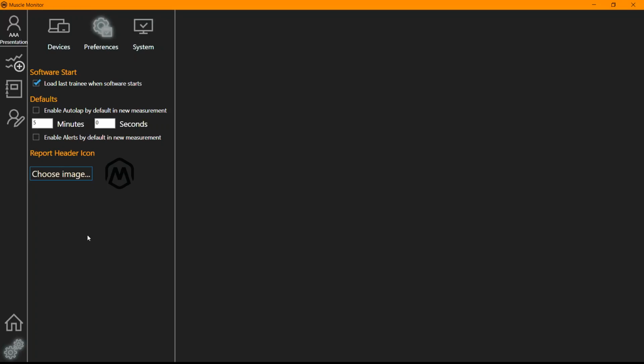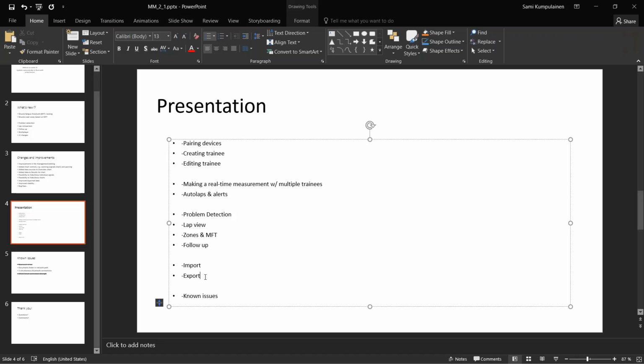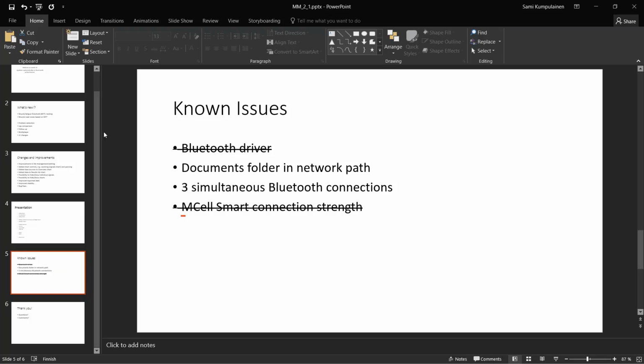Okay, that's pretty much about it. Some known issues that we have had: maybe two more serious ones, and a few not so serious ones.